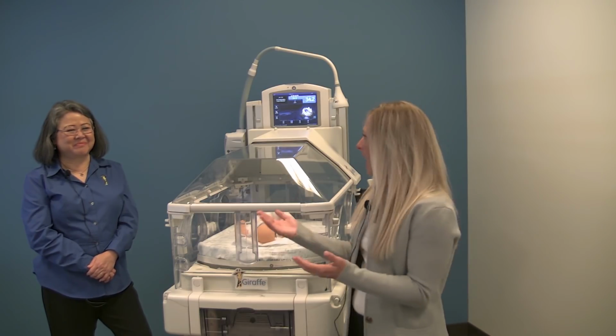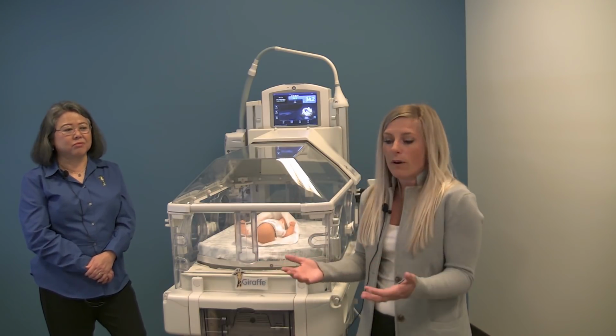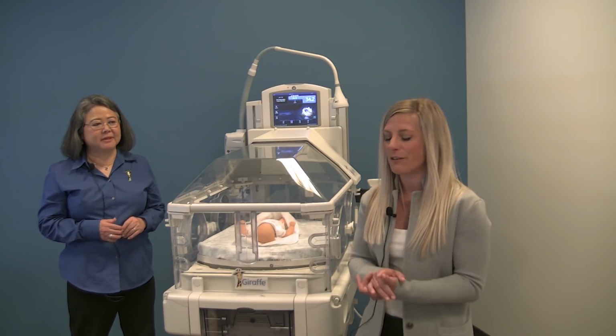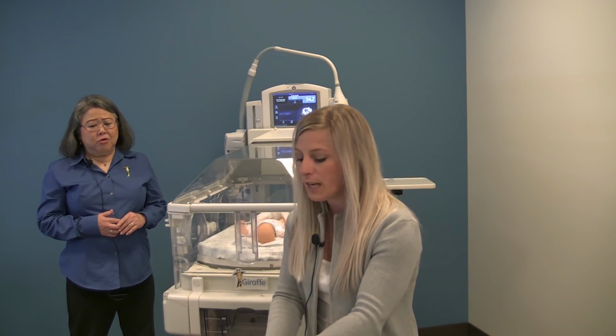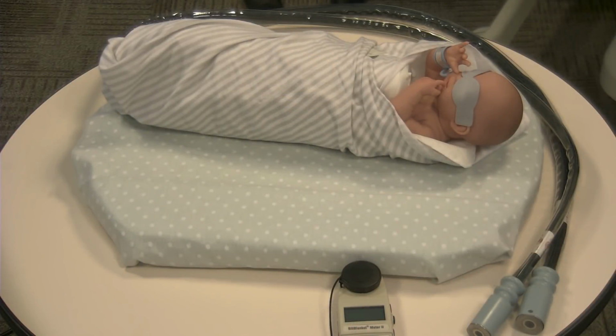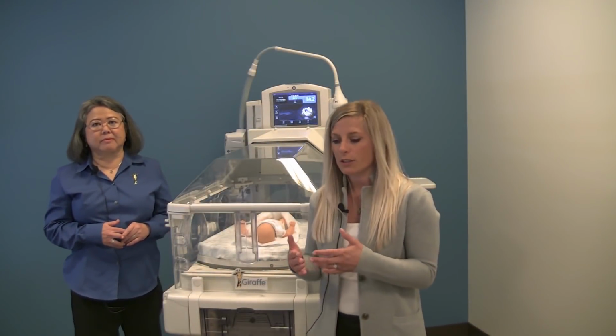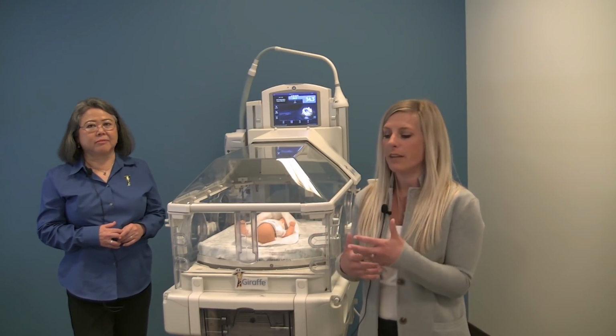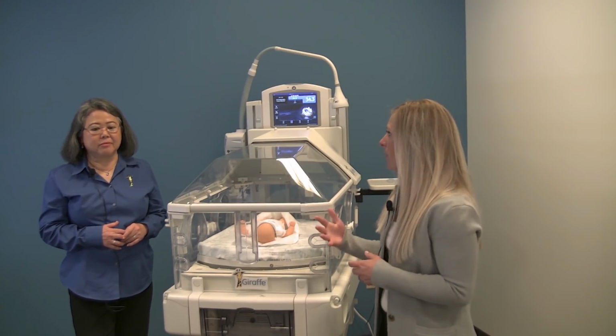And of course at night, they may shift, right? And that's okay. That happens in the real world. That happens in NICUs across this country. So really just periodically check on their eyes, make sure those patches are in place and you're good to go. It certainly wouldn't preclude you from doing in-room phototherapy. All those concerns can be addressed, and definitely involve mom and get her active. They want to be advocates and team players.